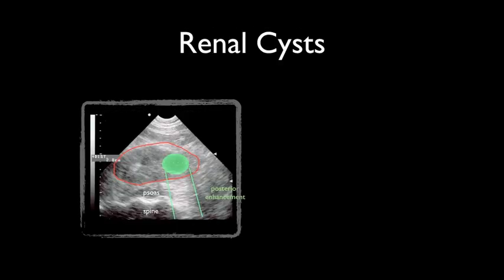Renal cysts can sometimes be mistaken for hydronephrosis. Cysts are typically single and arise in the periphery of the kidney, but can be multiple, as in polycystic kidney disease.